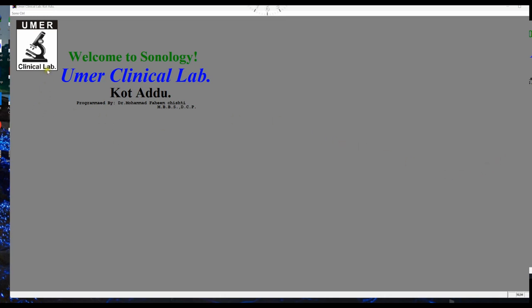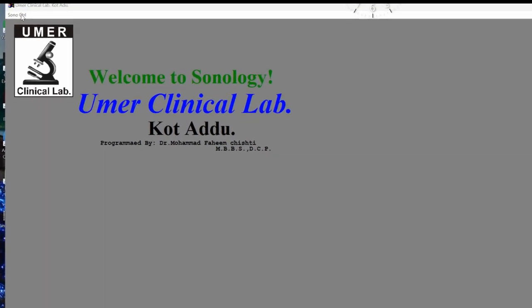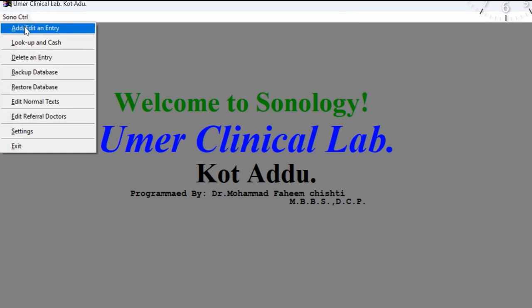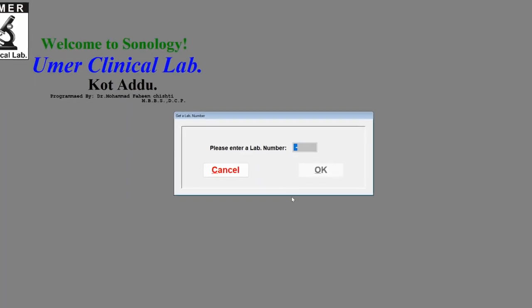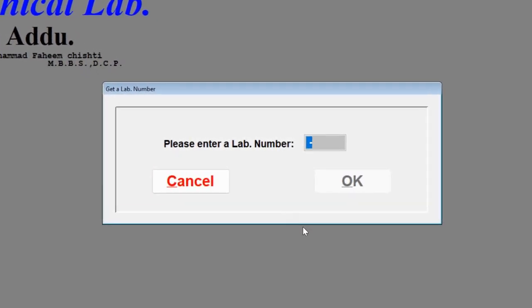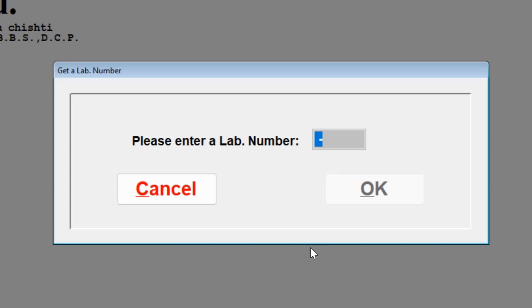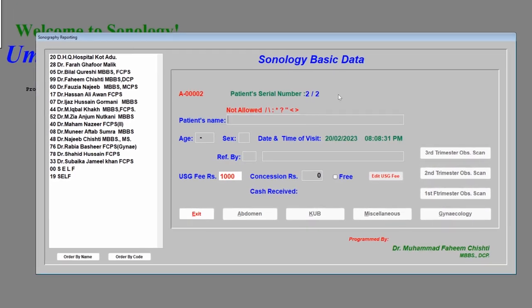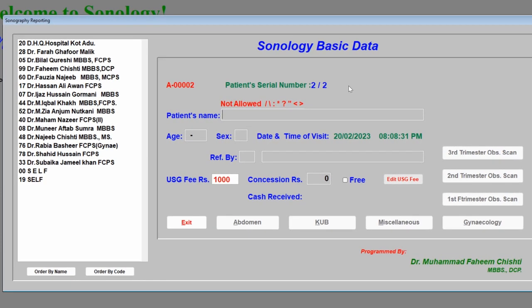Click on the SonocTRL menu item in the top left corner, click 'Add/Edit Entry'. Here you will enter the ID number of the patient — suppose it is 00002 — and click OK. Write the name of the patient; suppose it is Salma. Then enter the age of the patient; suppose she is 34 years.